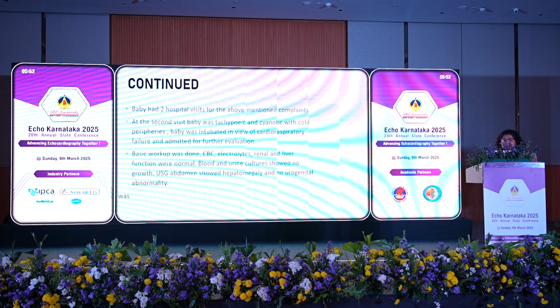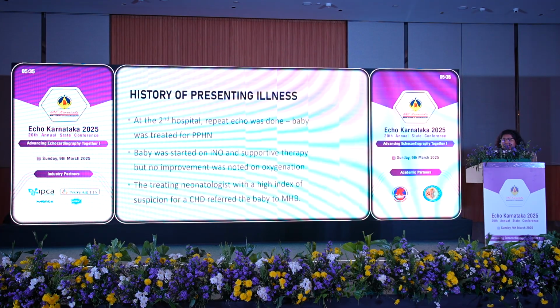After which a 2D echo was done, and the diagnosis of PPHN was made, and the baby was started on IV sildenafil, but there was no improvement, and the baby was referred to a higher neonatology center for inhaled nitric oxide therapy.